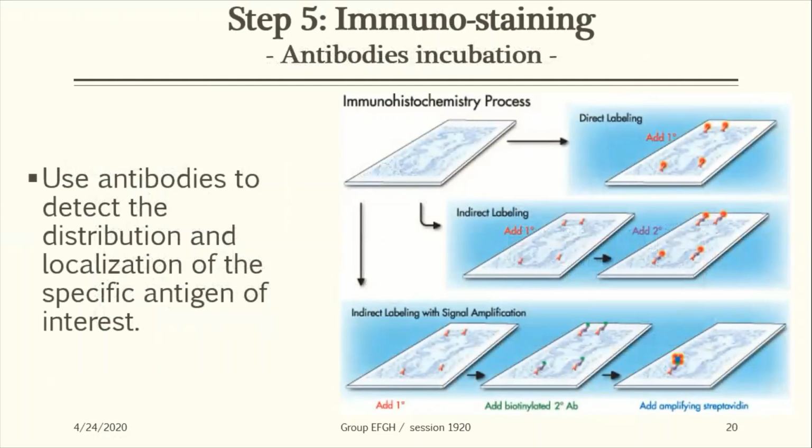Moving on is the crucial part of immunohistochemistry, IHC, which is immunostaining. So, IHC markers specific to the disease condition, which we call antibody specific to antigen, are chosen based on the tissue type and clinical relevance.